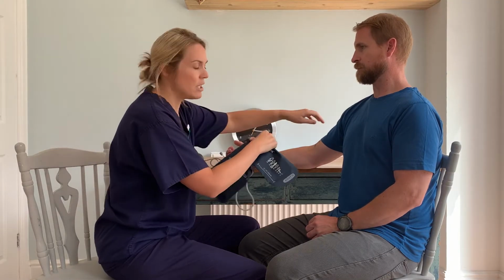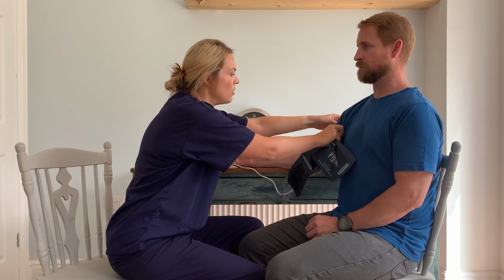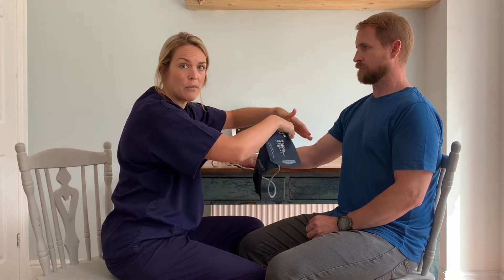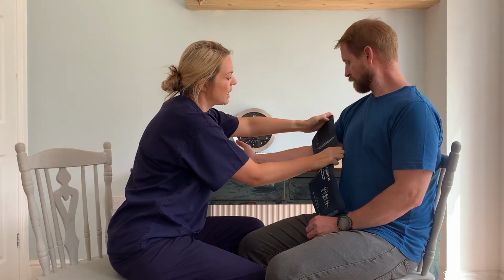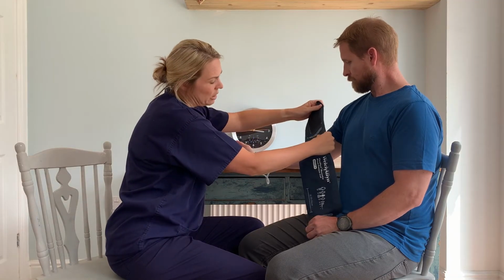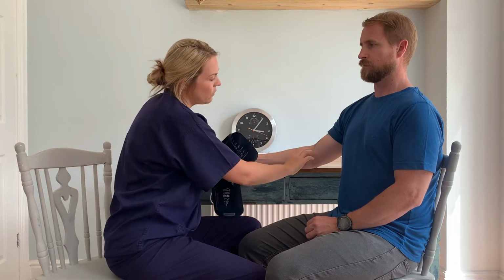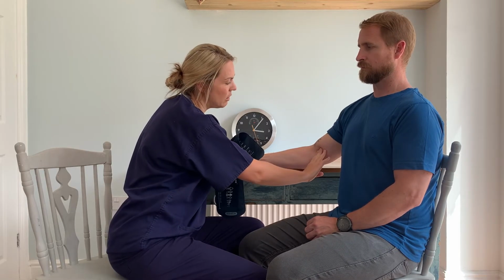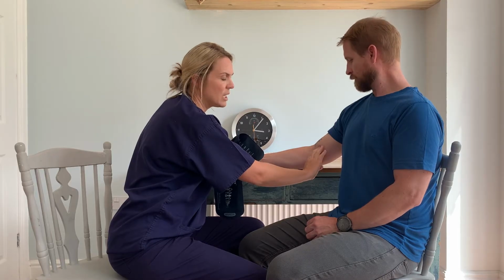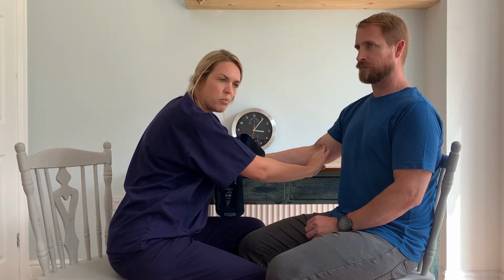Making sure that there is no clothing in the way, or if it is, it's removed and just rolled up out of the way so it's not again going to impede your cuff and give you an inaccurate reading. So I'm looking at placing this artery marker over the brachial artery, so I'm just going to feel for that. I'm using the crease of the arm with the antecubital fossa. We're looking at about 2 centimetres above this and slightly on the inward line, and you should, around this area, be able to feel the brachial pulse.